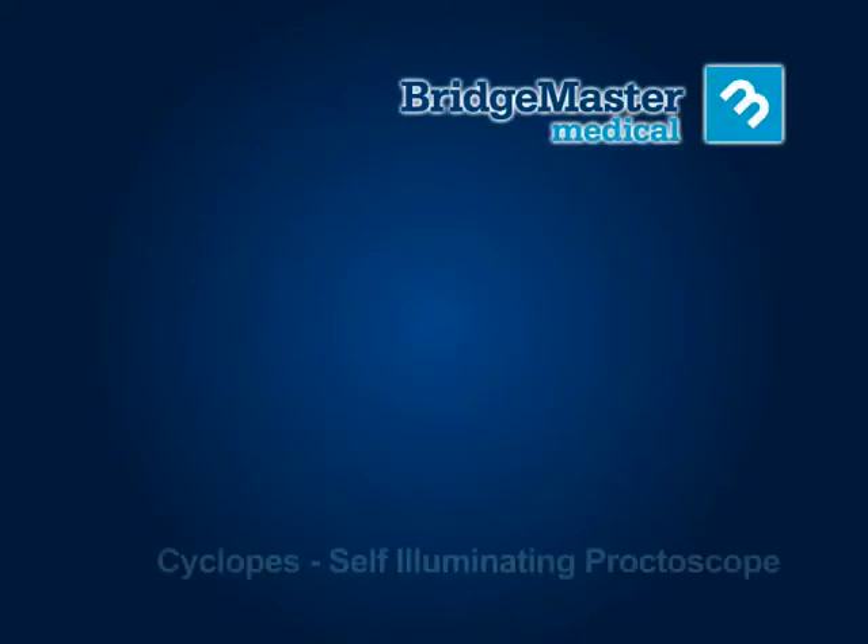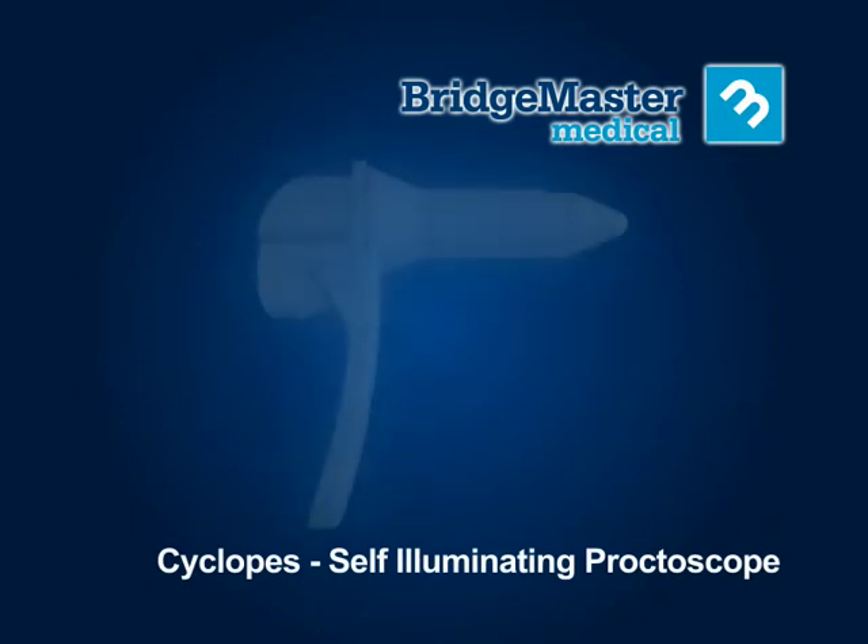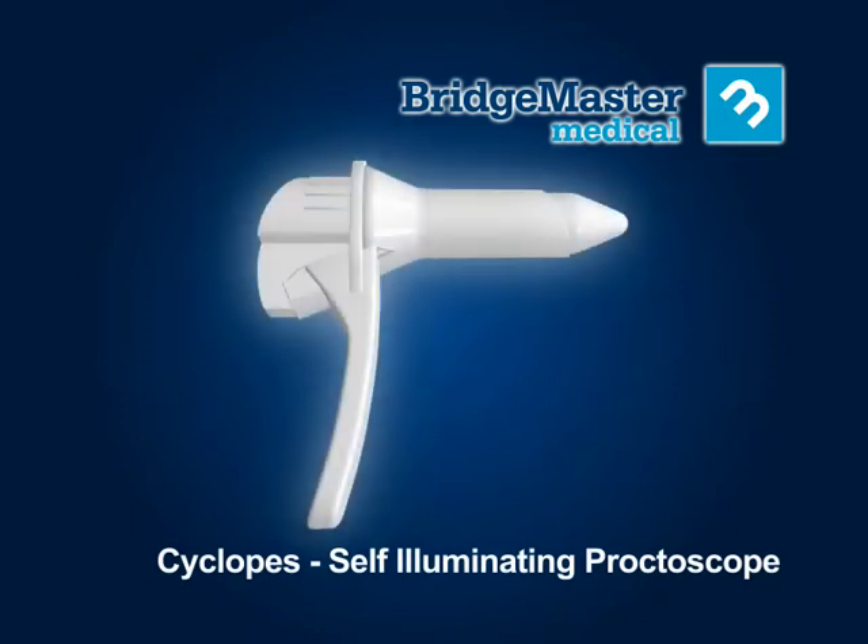Bridgemaster Medical introduces the Cyclopes, one of the first fully disposable proctoscopes with its own integral light source.